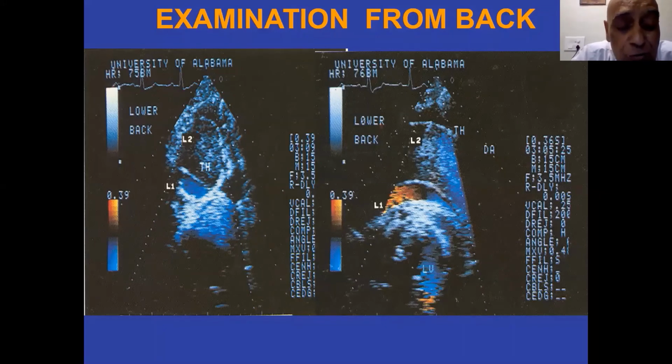That's a very good view to interrogate the right pulmonary vein. You have to put the color Doppler on, and you have to lower the scale to about 20 centimeters per second, or even sometimes lower. And the left pulmonary vein is just next to the atrial appendage, which is going to move downward. You'll get a blue colored flow over there. And you'll get the left inferior pulmonary vein very close by, closer to the roof of the left atrium, where you'll have a red color flow coming.